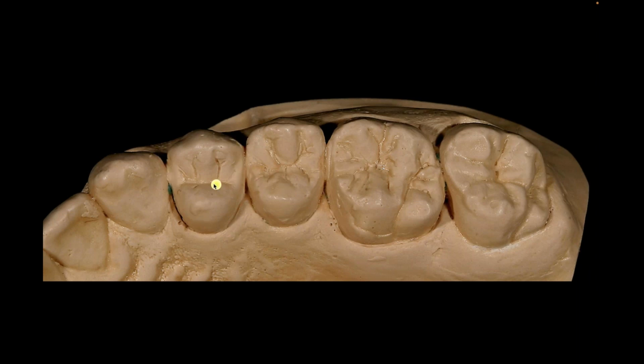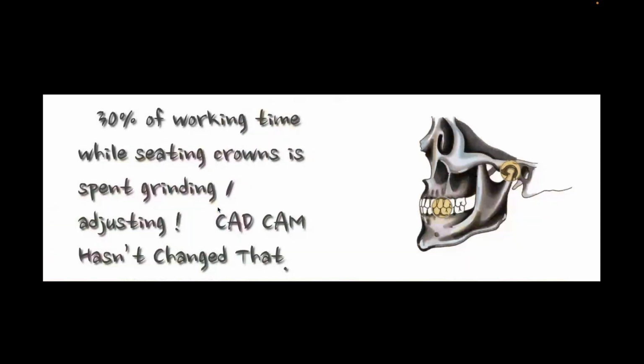Look at the wideness of the buccal portion of the tooth and look at the narrowness of the lingual portion of the tooth, which is the functional area. So again, a computer's not showing you that, right? That's your knowledge. You can grab as many libraries as you want and put them into a model, but without the understanding of why you're doing it, you've really lost.